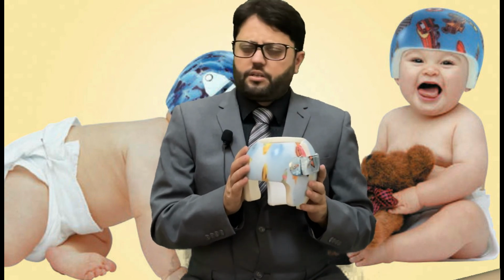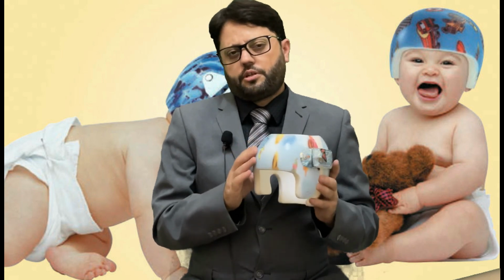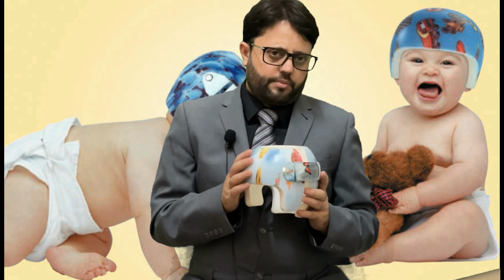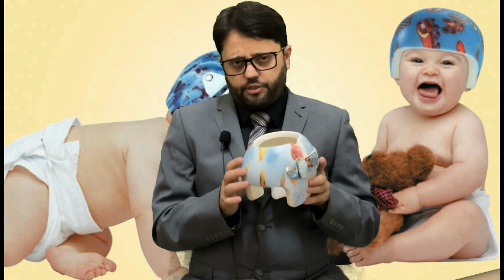We have a success rate of about 90%. We can get the improvement, and in mild cases, even 100%. This depends on how the parents use the cranial remolding orthosis. Once we have fitted it, we tell them to come back after 1 week for a follow-up appointment, where we see if further adjustment is required.